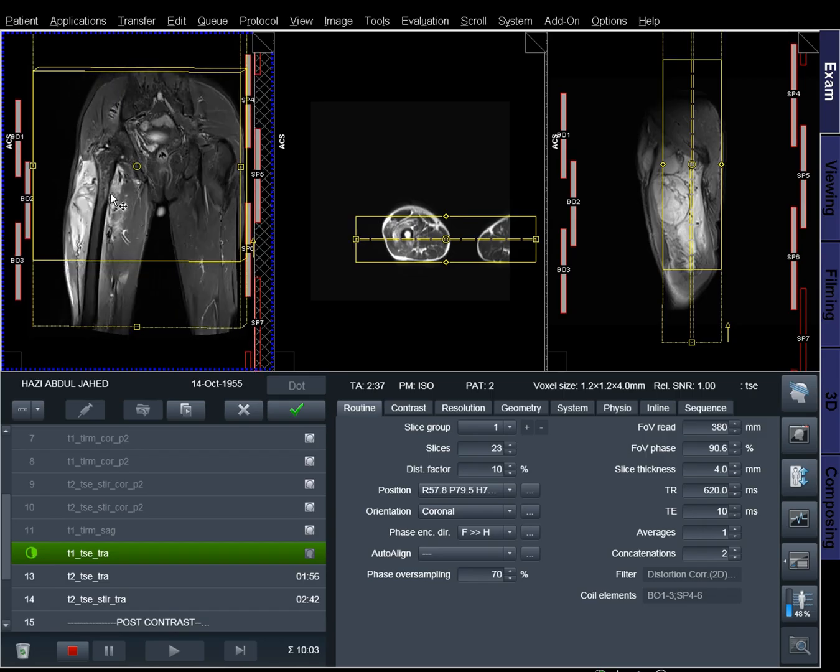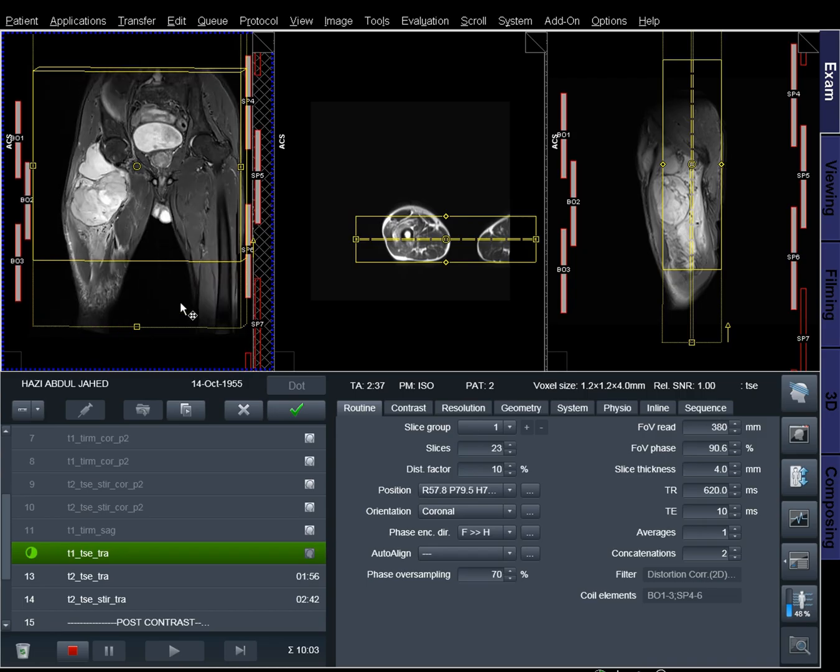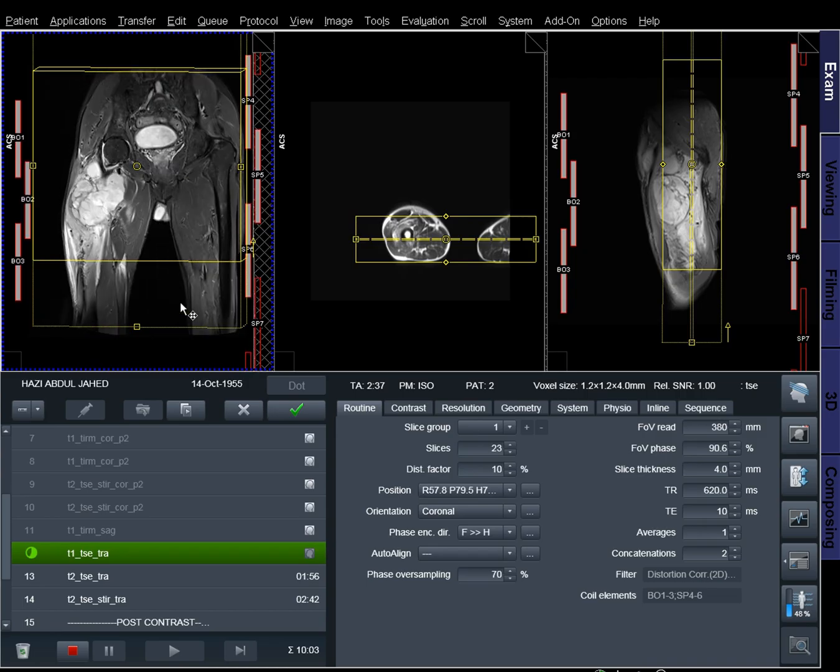Patient preparation. A satisfactory written consent form must be taken from the patient before entering the scanner room. Ask the patient to remove all metal objects, including keys, coins, wallet, any cards with magnetic strips, jewelry, hearing aids, and hairpins. If possible, offer someone in the scanner room for a claustrophobic patient, for example, a relative or staff.